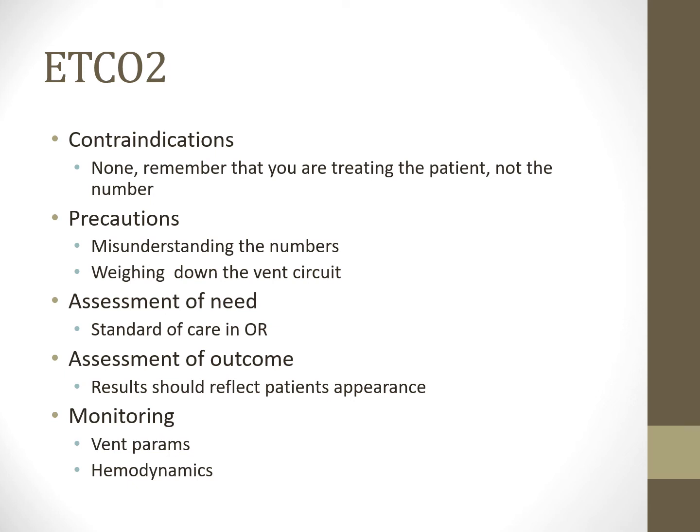their saturations drop. So even in conscious sedations, end-tidal CO2 is extremely vital because that patient could easily, if they're given too much of that medicine, could easily hypoventilate, and their pulse ox will be just fine, but now they're getting acidotic, and you wouldn't know it unless you had end-tidal CO2 on. So, of course, it's going to be a big thing here.